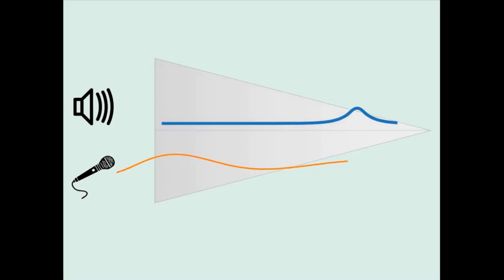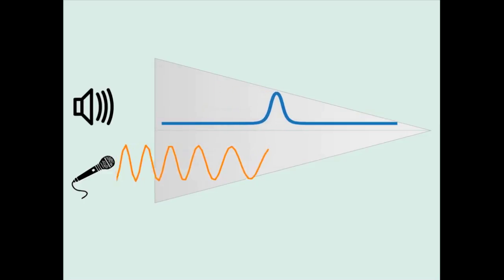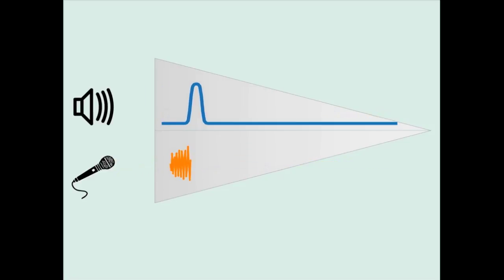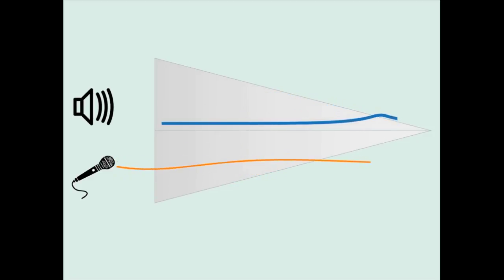not be able to see the low frequency emission, and also that the high frequencies come out so soon after the pulse that we have to be very careful when measuring the high frequency transient emissions that they're not contaminated by any residual energy that remains from the large transient stimulus.